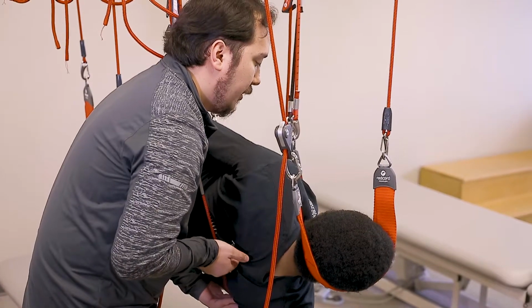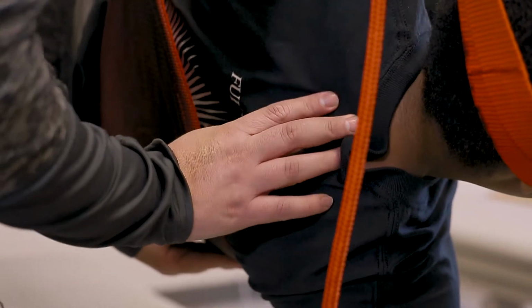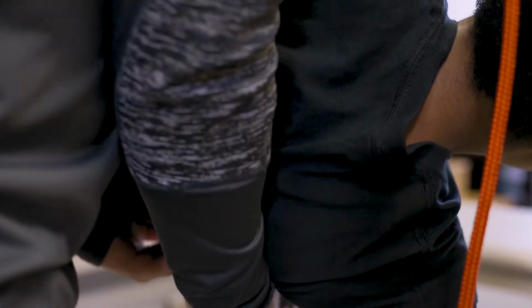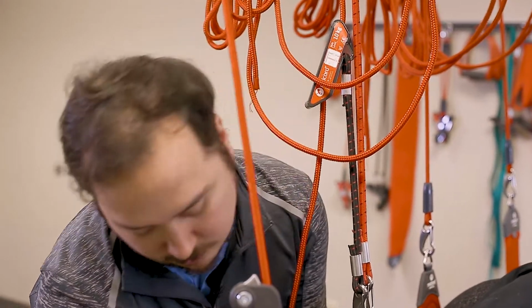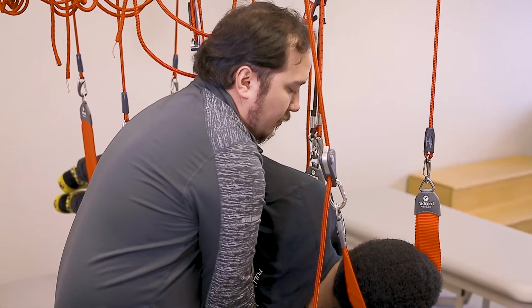What we're doing is we're putting bungee on the thoracic spine, and we're having her shift from a right thoracic curve into neutral. And when that happens, it's going to decompress the discs as well as allow the muscles to relax temporarily. And when we do this, we can also show them how they can do similar stretches at home, followed up by activations to help achieve the same goal.